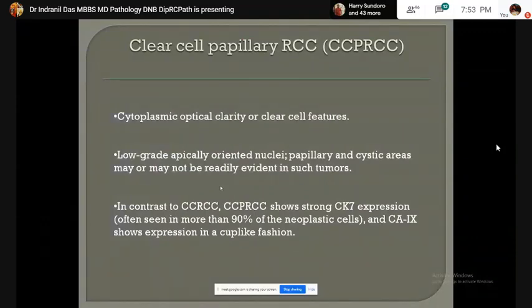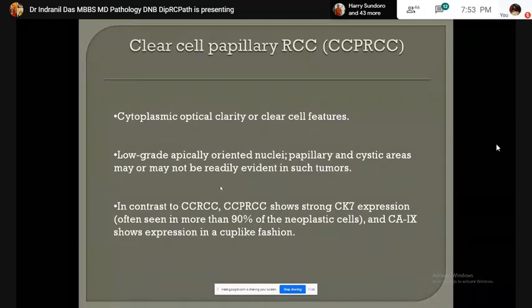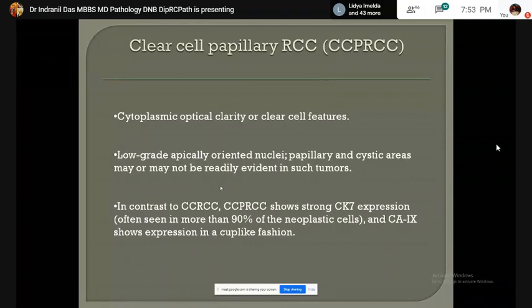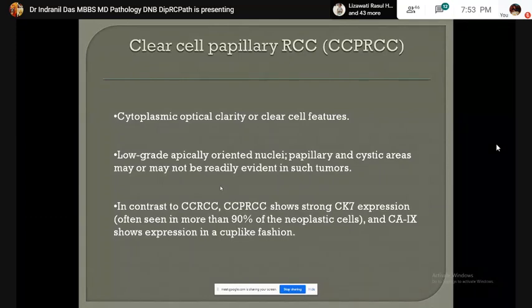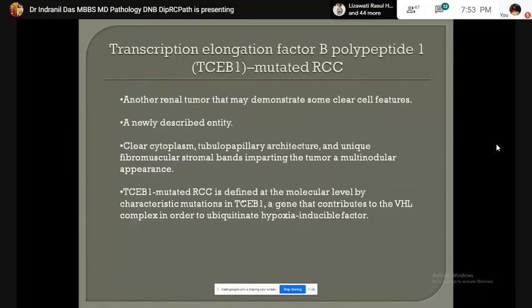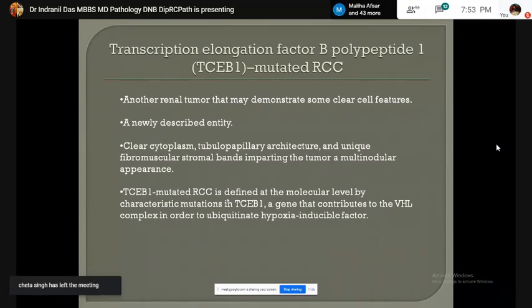The next entity is clear cell papillary renal cell carcinoma. Clear cells with low-grade apically oriented nuclei are present in this tumor. In contrast to conventional renal cell carcinoma, CK7 is diffusely positive and carbonic anhydrase 9 gives a cup-like reaction pattern.